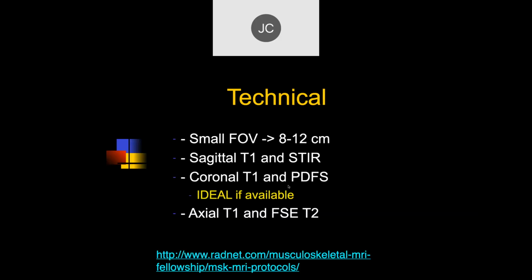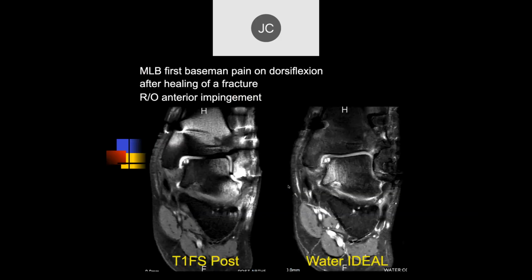So some people will just say short axis and long axis, and they're meaning with respect to the metatarsal bones in the foot and ankle. But just be aware of the potential of some miscommunication based upon the anatomy.